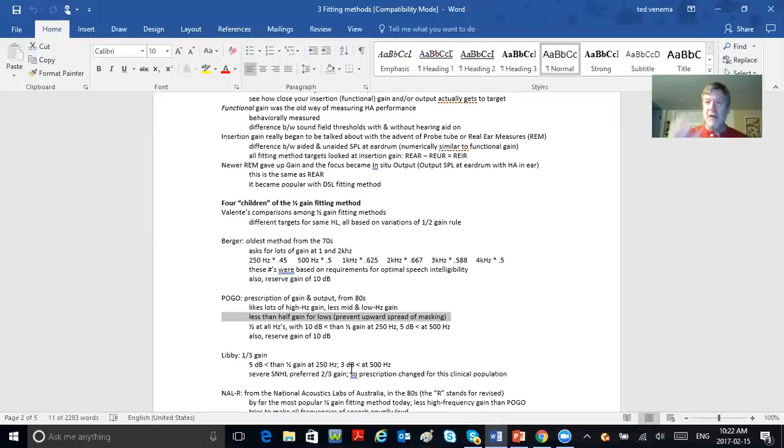And its tail, the shallow tail, slopes toward the base of the cochlea, toward the highs, and the steep wave front faces north, faces the apex, faces the lows.